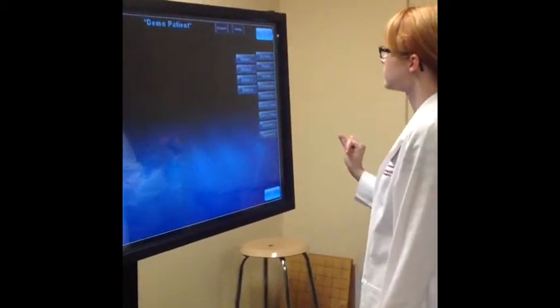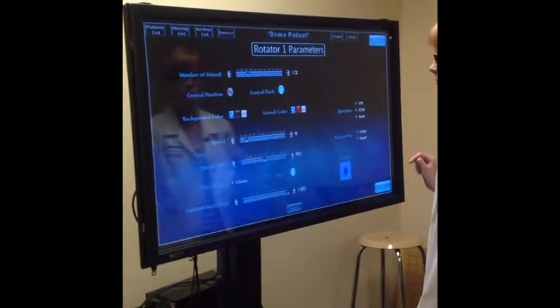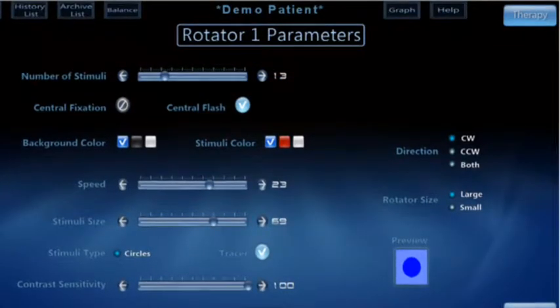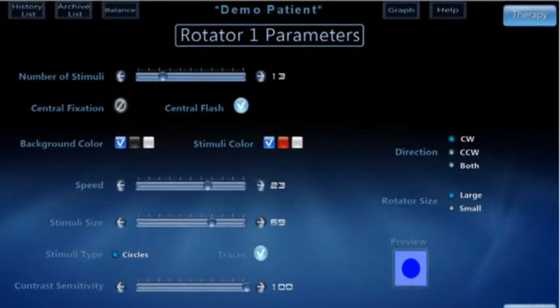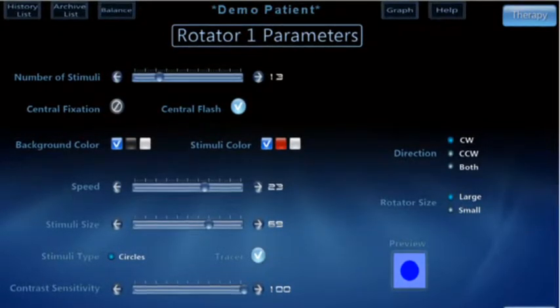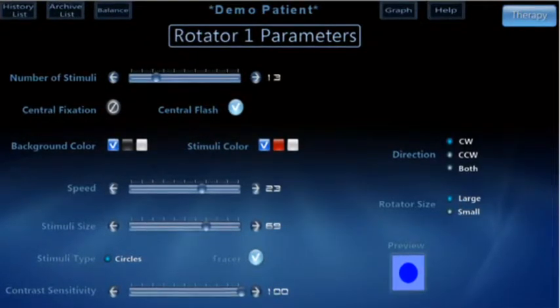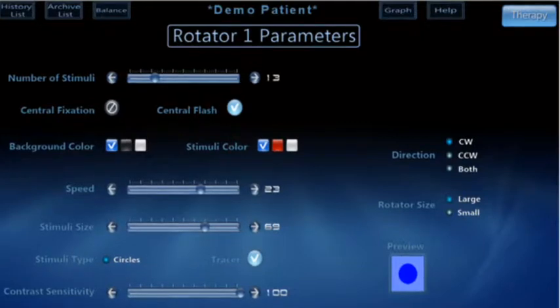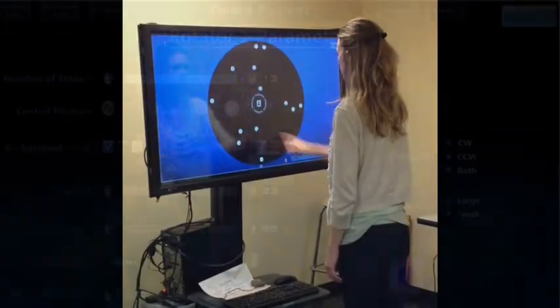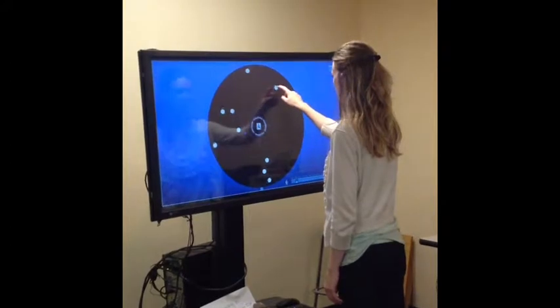The next section is the Rotator. Press Rotator 1. Here are the parameters for Rotator 1 — they are similar to the other parameter screens. You can change the direction of the rotation: clockwise, counter-clockwise, or both. You can change the Rotator size as well. In Rotator 1, the patient simply has to touch the targets.